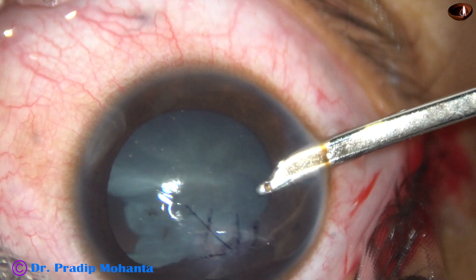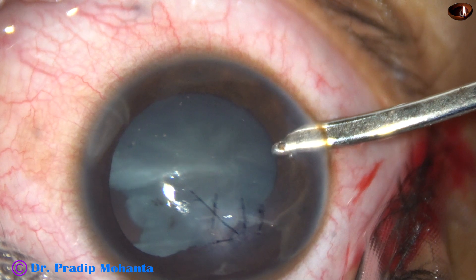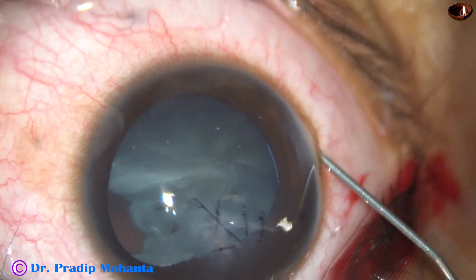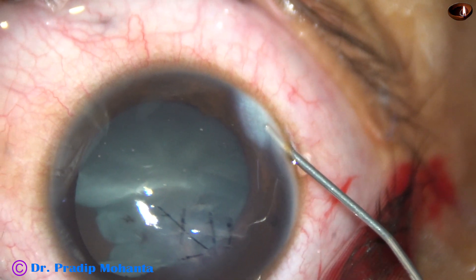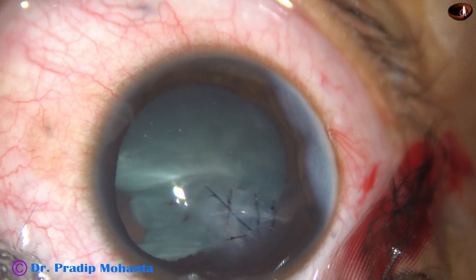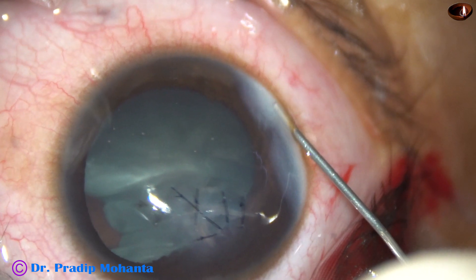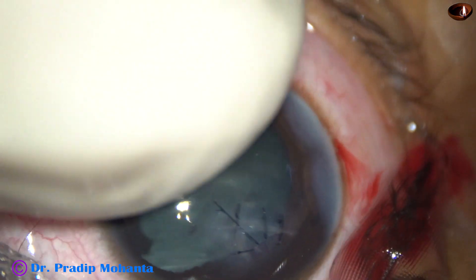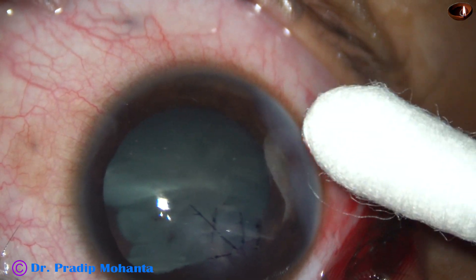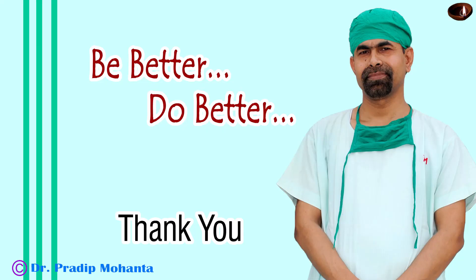We have to do a second surgery for this patient in about three weeks, but if the lens matter gets fluffy and fills the anterior chamber we may need to operate earlier. This is moxifloxacin being used to hydrate the cornea on either side of the stab wound — it is forming the anterior chamber as well as hydrating the corneal stroma and making the side port watertight. This is how we can repair corneal wounds. The wounds are checked and the case is concluded. Thank you very much for your attention.